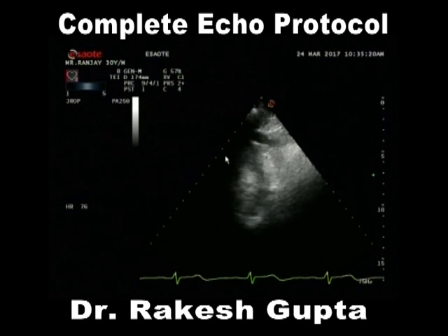And as I said a number of times, we need to look at 5 tricuspid windows for assessment of a TR gradient. We need to look at 6 aortic windows to look for a precise aortic valve gradient.